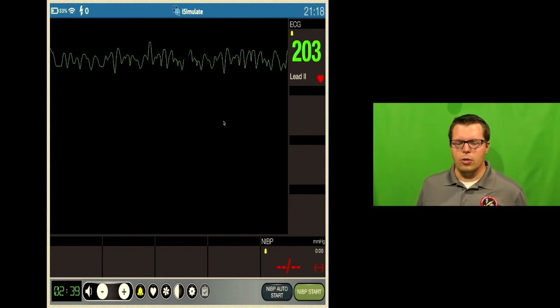So you do have to use some caution if you are going to try to fix their end-tidal measurement based on their respiratory rate. That said, give them a couple of minutes once you get the person on the ventilator or get the person intubated to see what their CO2 actually comes down to.